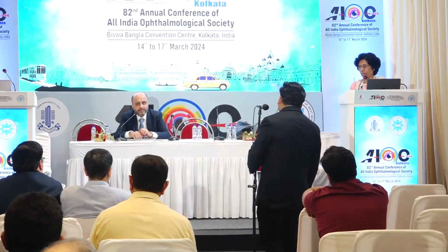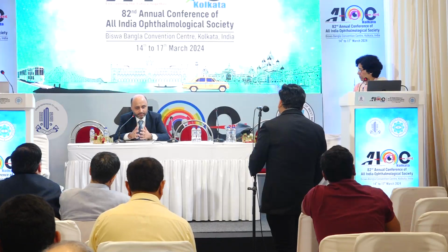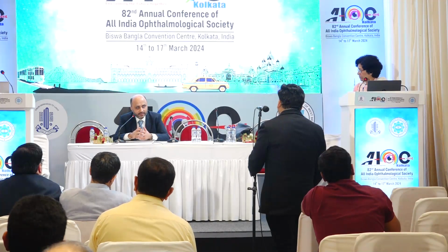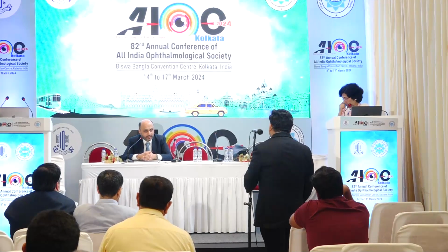Secondly, the choice of tamponade. I think usually what we follow is that if we have a combined detachment, though we are also shifting from that, especially chronic TRDs, or a chronic TRD converting into a combined detachment, oil usually was the earlier school of thought. But as of now, I think what I hear and what I also see is that oil per se, its action on the disc, is way more catastrophic than probably using gas. So what's your take on that?